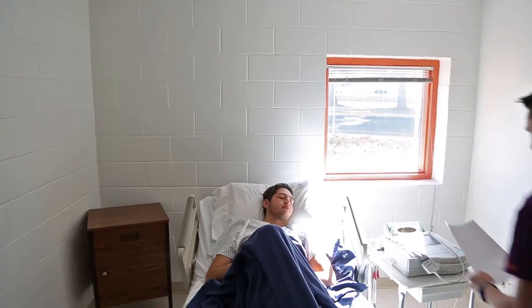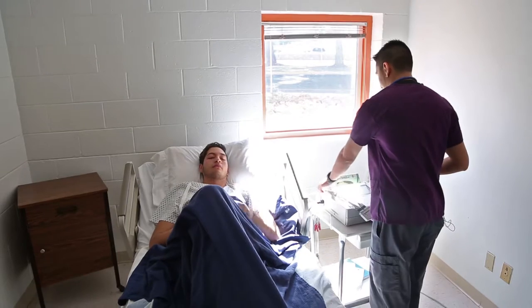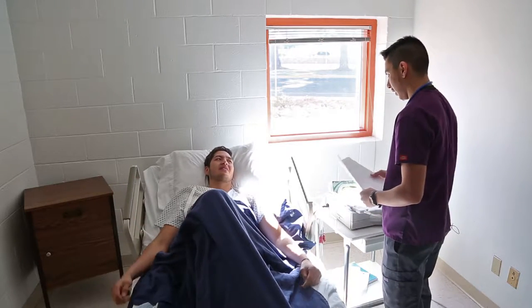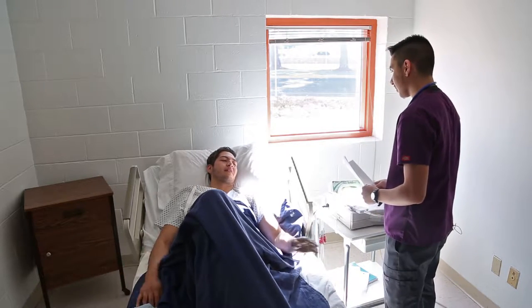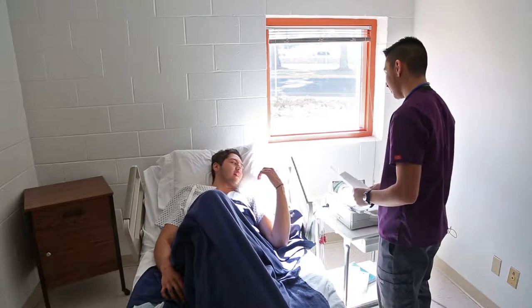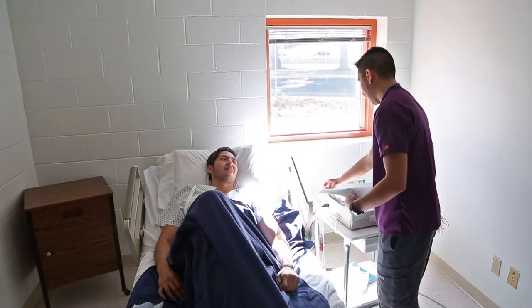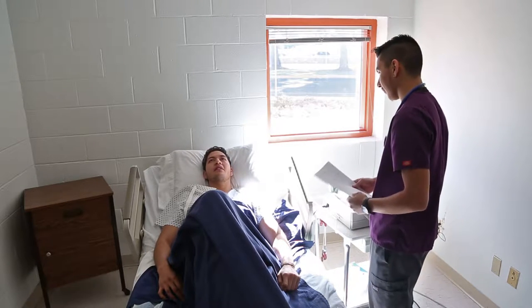Hello, how's it going, Mr. Marquez? My name is Edgar. We're going to be running the 12-lead ECG. Do you have any questions before we begin? Yeah — how long is it going to take? It should only take around 30 minutes or so. Did you wash your hands? Yes, sir, I washed them right before I came into the room. I have a question about the machine — it looks scary. Are you going to do something to me? No, we're just going to be looking at electrical activity of your heart. They don't do any kind of shocking or anything.